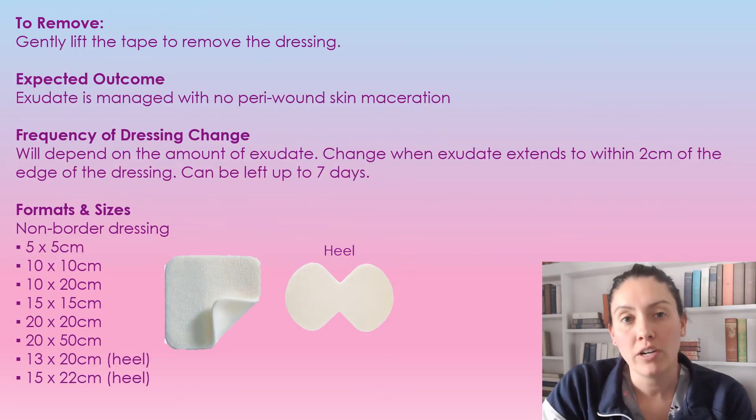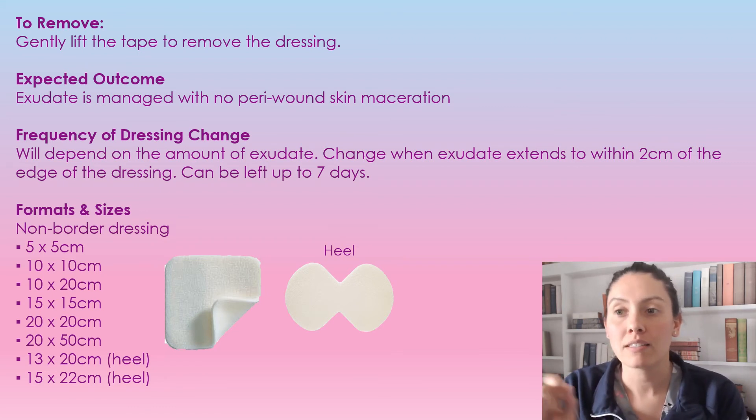To remove this dressing, you're just going to gently remove the tape or cling and peel up off the dressing just nice and slowly.